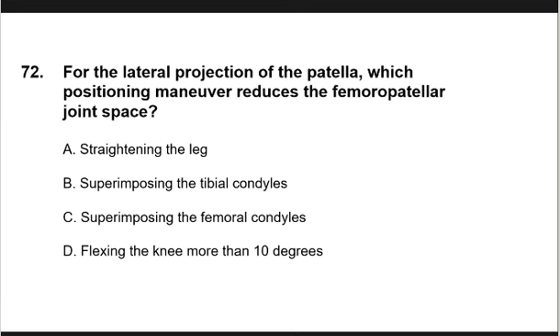Okay, next question. For the lateral projection of the patella, which positioning maneuver reduces the femoropatellar joint space? So in other words, pag sinabi nating patella, that is referring to the largest sesamoid bone of the body, which is located on top of the knee joint.